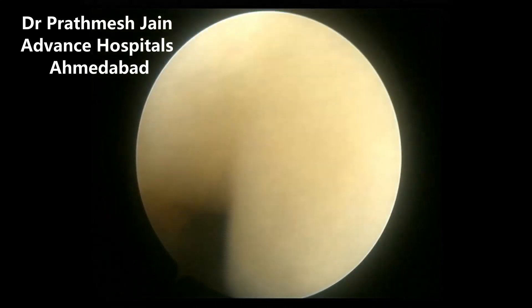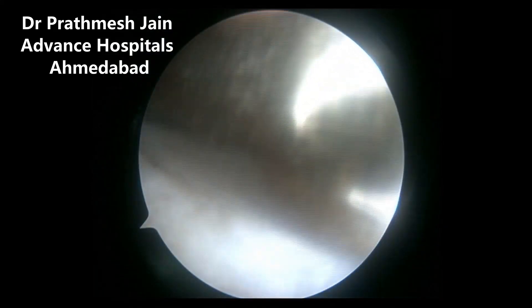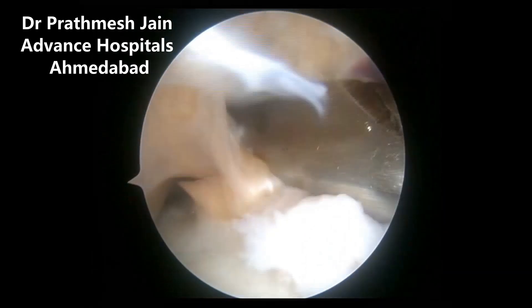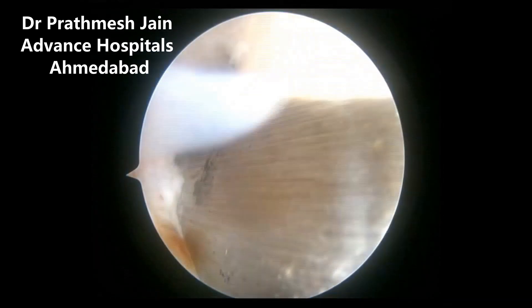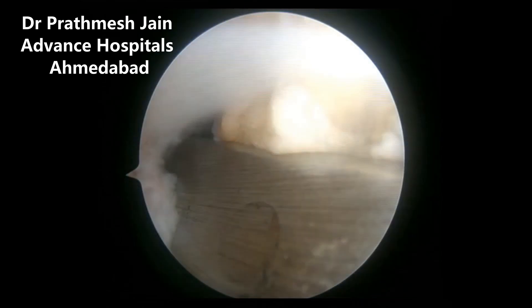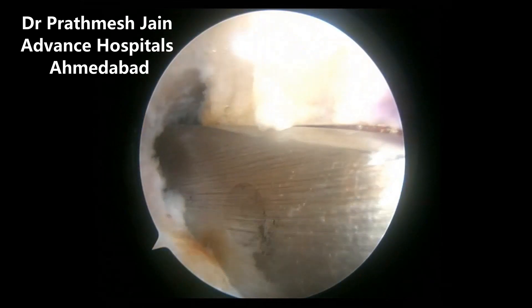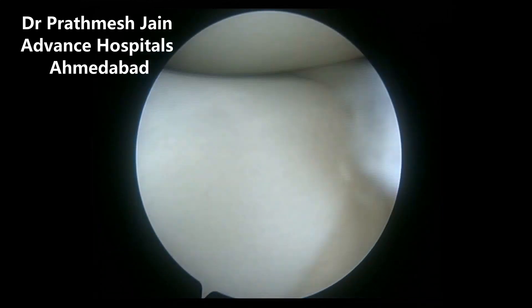the femur, we will insert an artery forceps into that area and feed the sutures, which are prepared on the ITB autograft, into the tip of the artery forceps. This artery forceps is then pulled up into the joint. By doing this, we have passed the graft just posterior to the femoral footprint, which is quite anatomical.